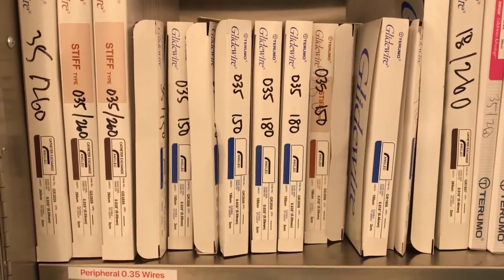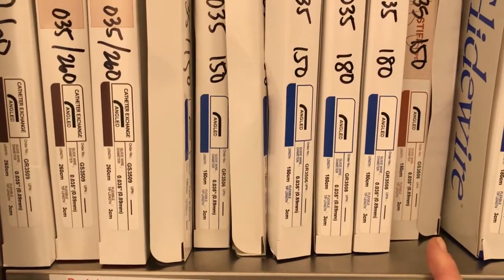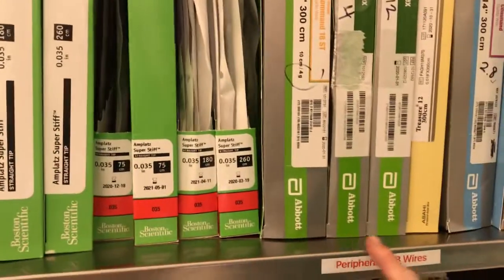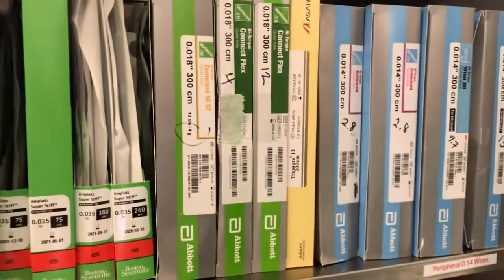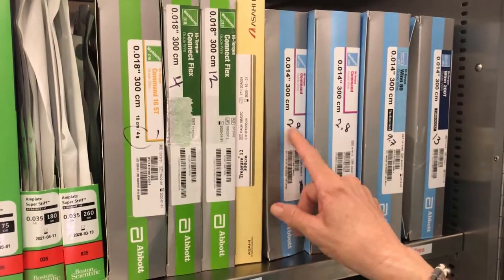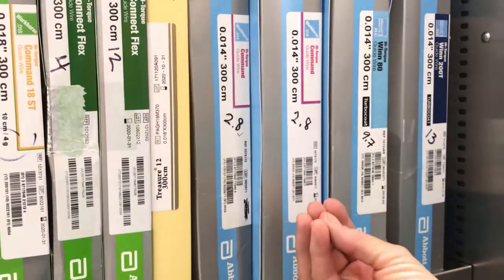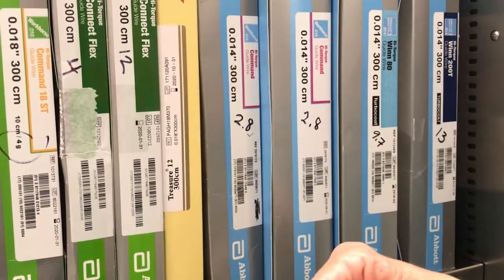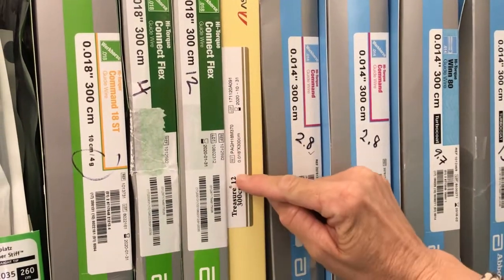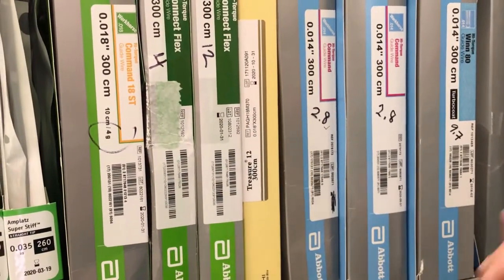On the peripheral shelf, physicians may want to start with an 0.035 wire — available in long and short versions here — or they may want to start with an 0.018 system or an 0.014 system. In either case, whichever wire they're starting with, you again start with a low tip weight, such as the Command at 2.8-gram tip weight. Then they escalate, just like in the coronaries, to a heavier-weighted wire if not getting across the lesion — such as a Connect Flex at 4 gram, or a Treasure 12 at 12 grams of force. We're always starting with low tip weight and escalating until we get across the lesion.